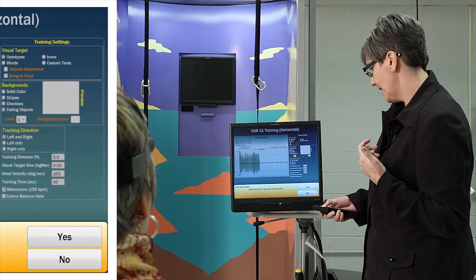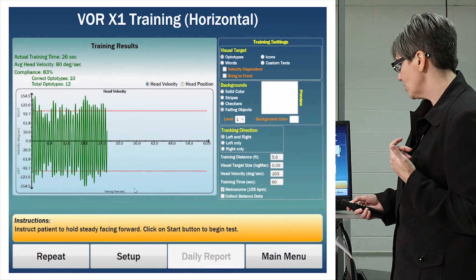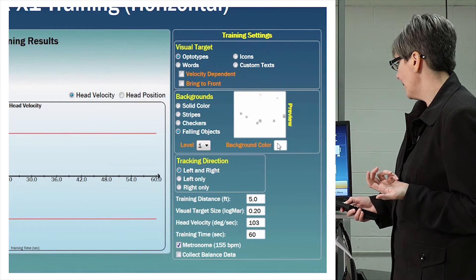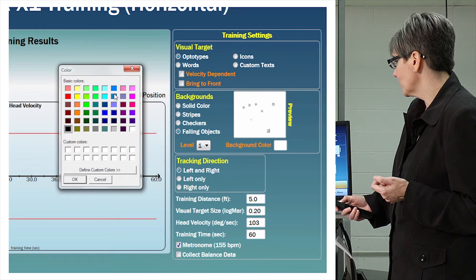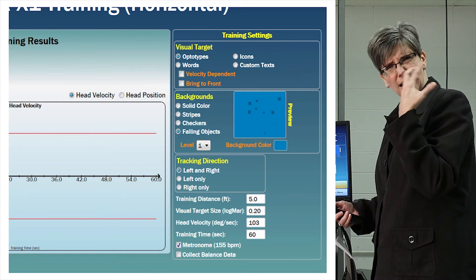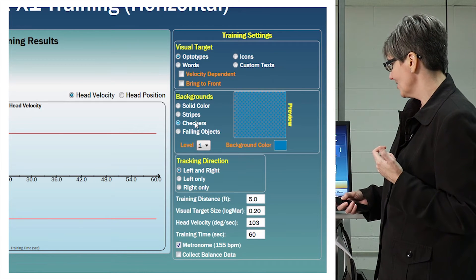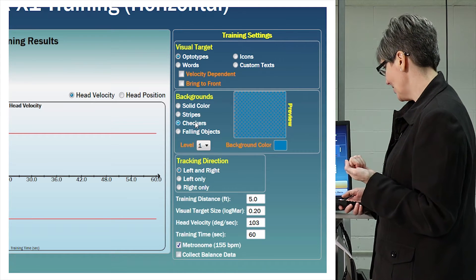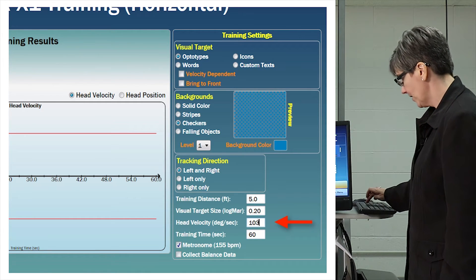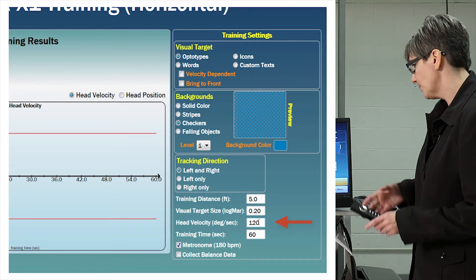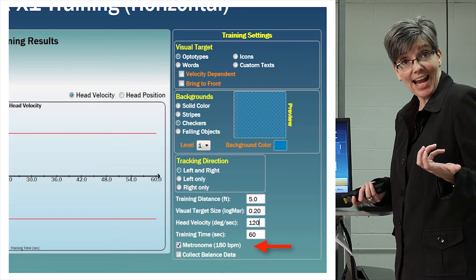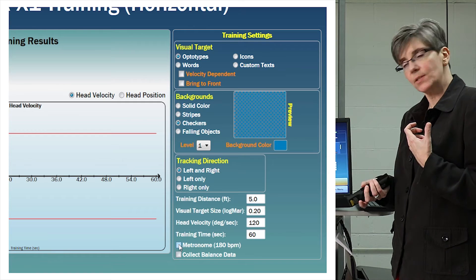If I choose not to save this training, I can repeat the trial and make things more difficult for Mary. For example, I can change the background color, add checkers to the background, or speed up the head velocity in degrees per second. Maybe I want Mary to work at 120 degrees per second — the metronome setting automatically changes to 180 when I change to 120. I can also turn the metronome off for this particular exercise.